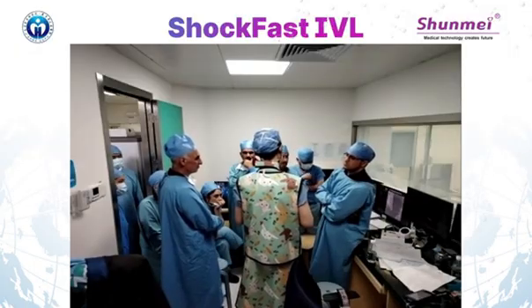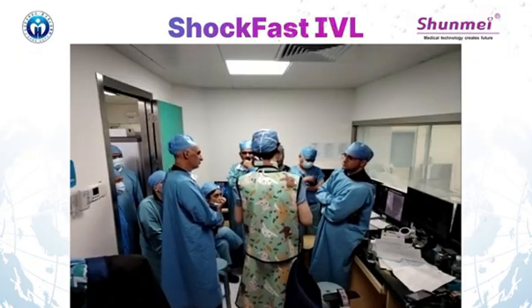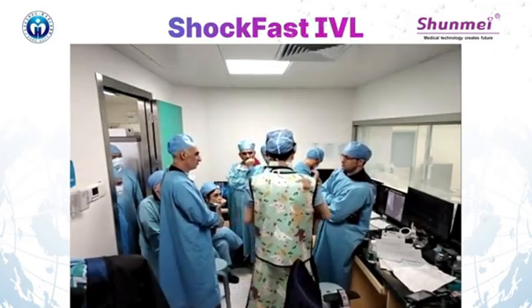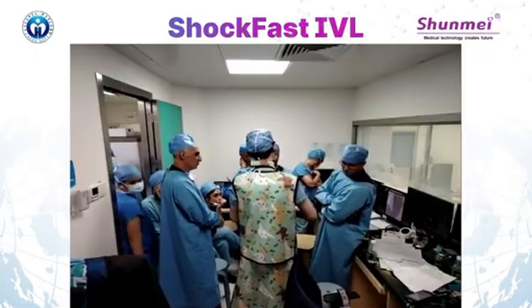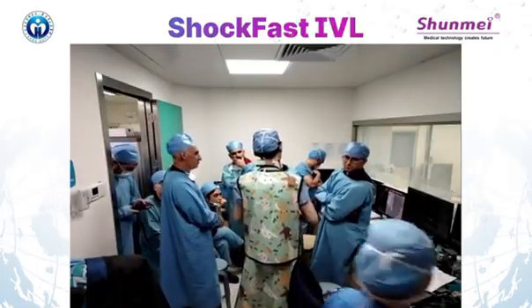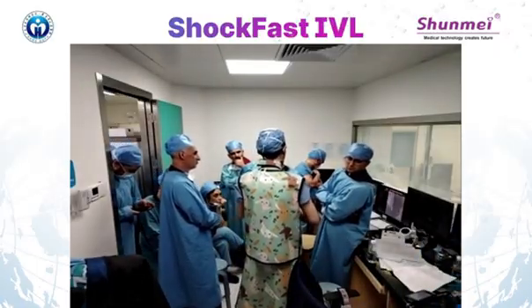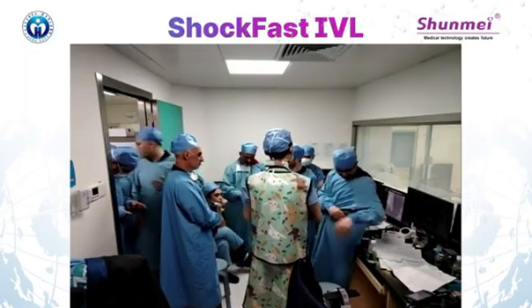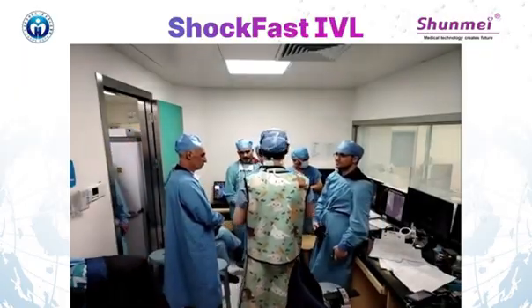Secondly, you very well demonstrated the balloon anchor technique, advancing the guide extension after distal anchor inflation. Very good. Thank you very much. That's really my pleasure to discuss.